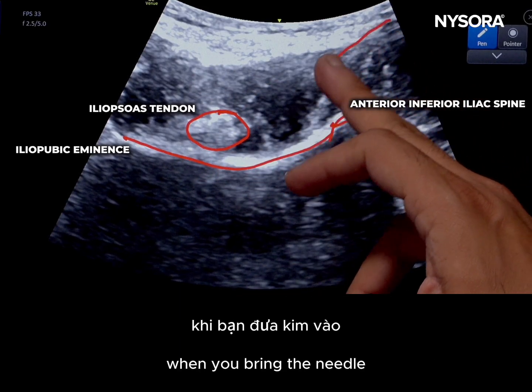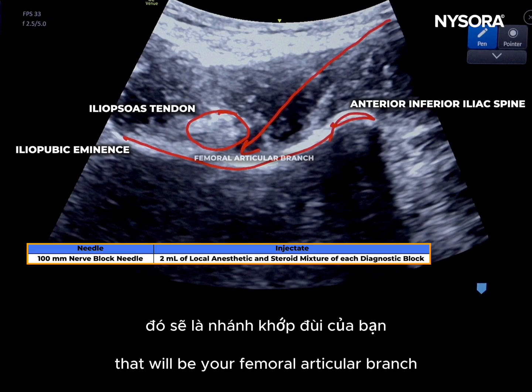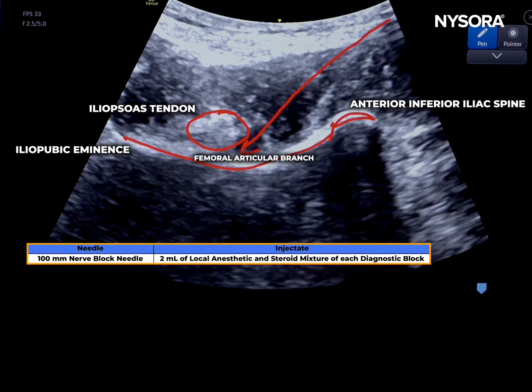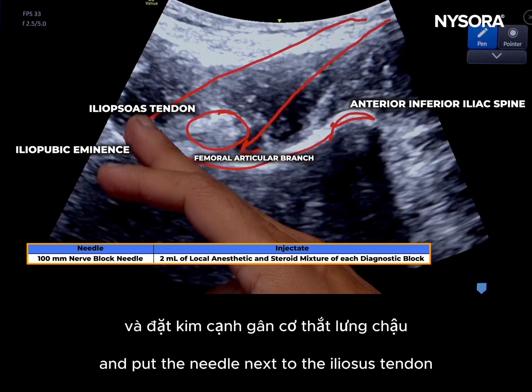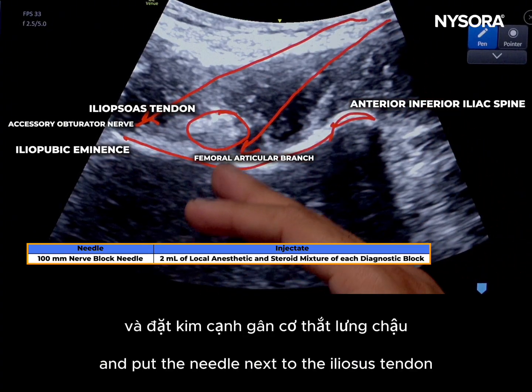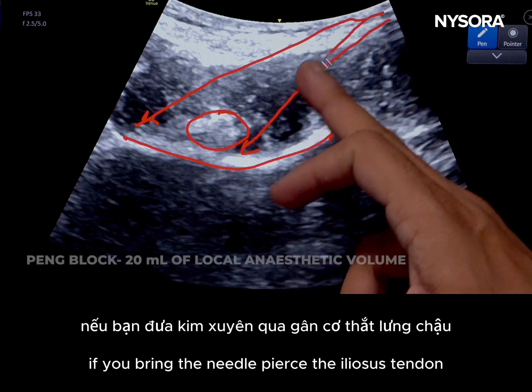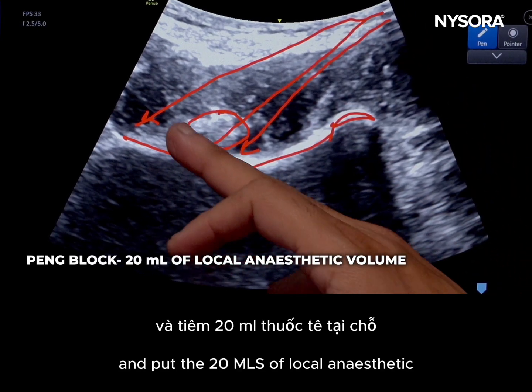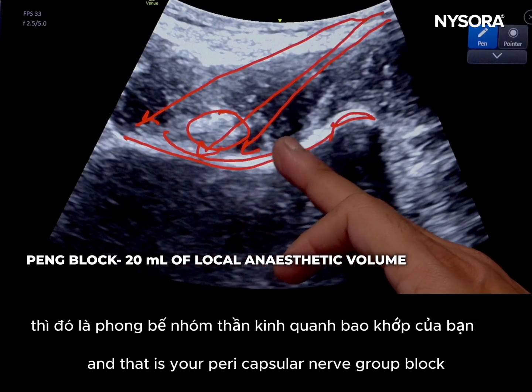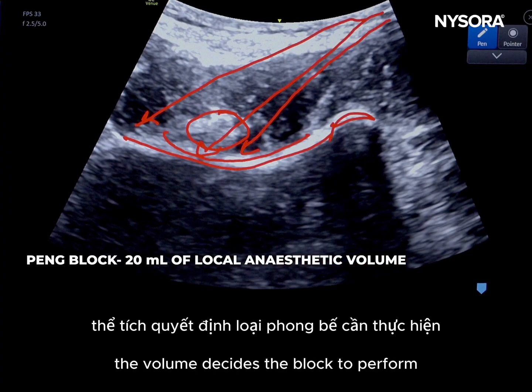When you bring the needle and put it lateral to the iliopsoas tendon, that will be your femoral articular branch to the hip joint block. When you put the needle next to the iliopsoas tendon on the medial side, that will be the accessory obturator nerve block. If you bring the needle, pierce the iliopsoas tendon and put 20 ml of local anesthetic, that is your pericapsular nerve group block. The volume decides the block.